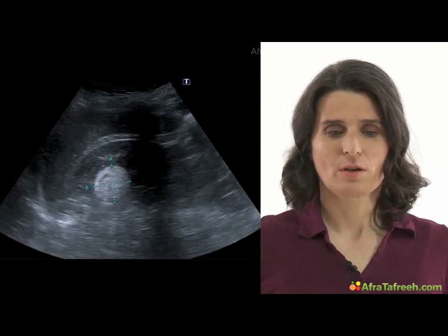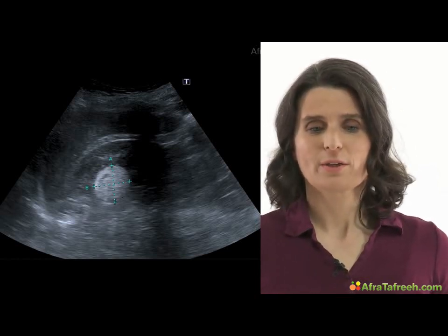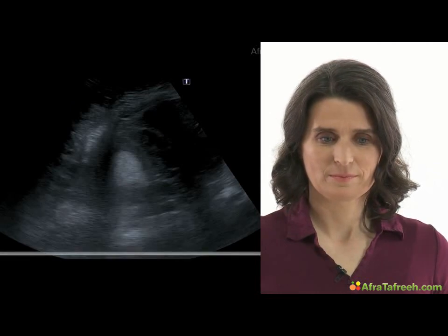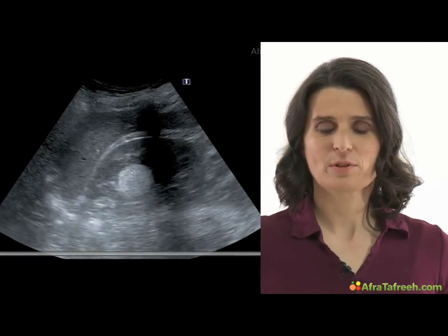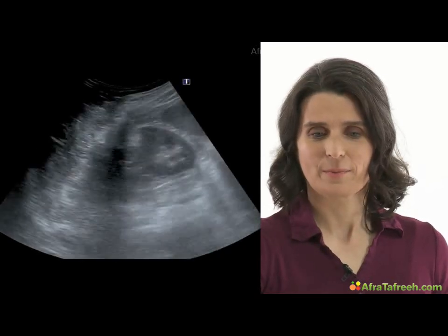Here an image of a larger renal angiomyolipoma, also like you have thrown a white ball into the kidney. Here, the same lesion. In the video clip, typical features of a renal angiomyolipoma. In this case, the right kidney.